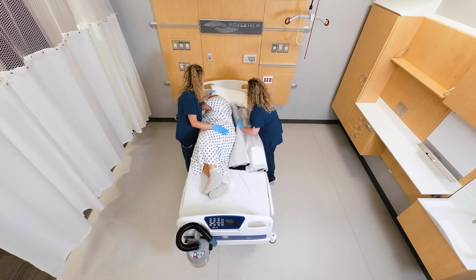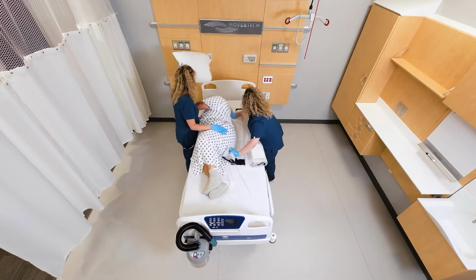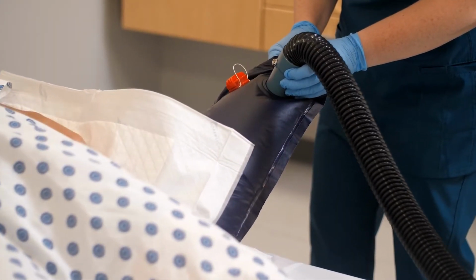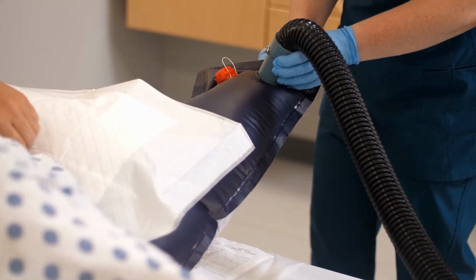More than one caregiver may be needed for additional tasks using the Q2Roller. Using the variable speed Hovertech air supply, each of the two adjustable chambers can be inflated to gently roll the patient to a 30-degree or to complete a side lying position.